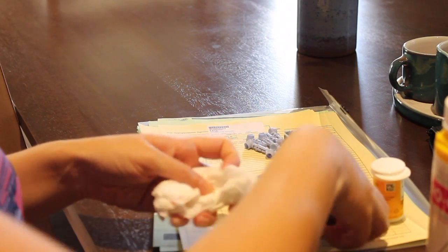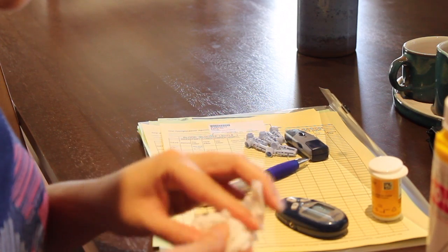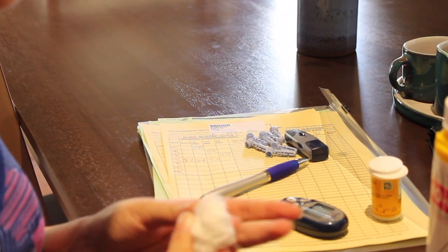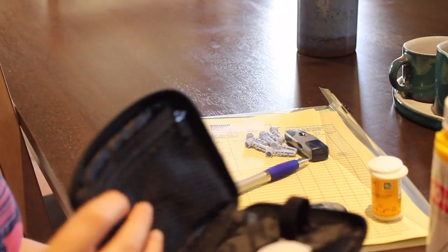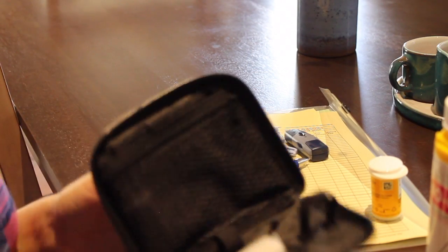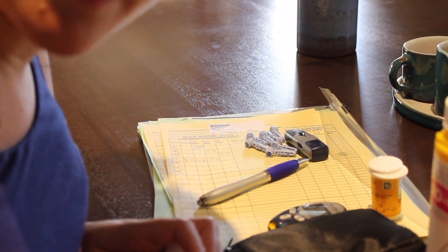So here we go. I'm going to remove the test strip, wrap it up in the tissue, and dispose of it, and then put everything away in my handy little pack here. And go on with the rest of my day. I have one more reading to do one hour after dinner, but until then I can relax and enjoy the rest of my day.